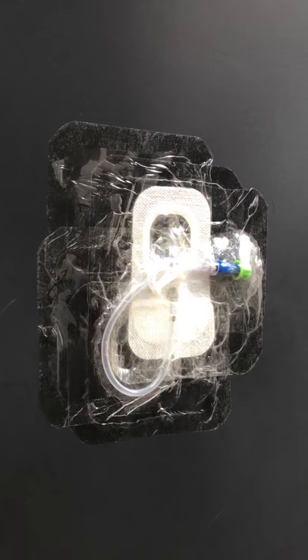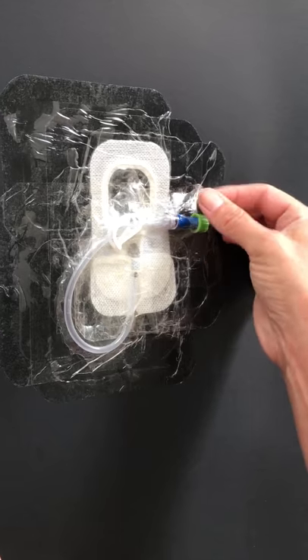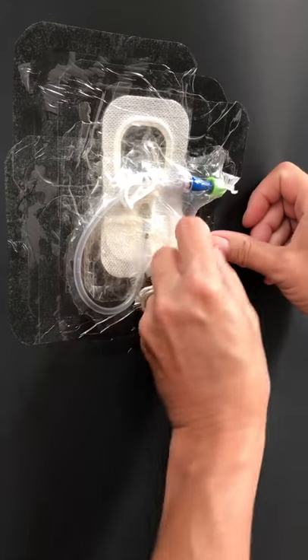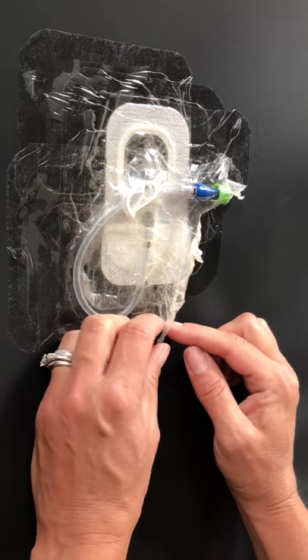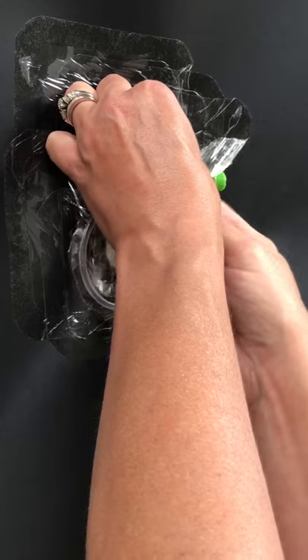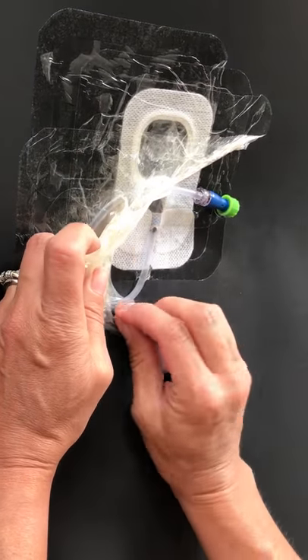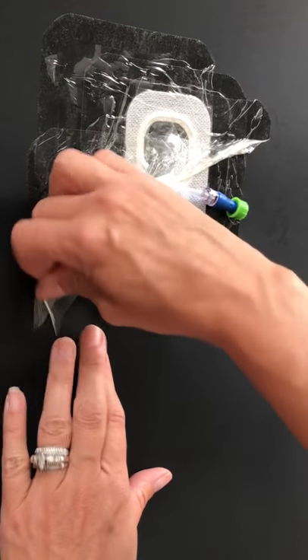With that sterile dressing and the Tegaderm that's in there, if it's fairly new — within the last day or so — you could usually just pick off the Tegaderm that you put on there for them to go swimming, just start by picking at it. It would come right off without even messing with the original Tegaderm. It's not even touching the original Tegaderm that I had down. Now, if that's an older dressing, yes, it's probably going to start peeling at it. You don't want to do a dressing change, but you need to have access to the site — just pick off as much as you can. Be very careful that you don't pull on the line, and just bring the line out to where you can access it. Most times it doesn't even mess with the old Tegaderm underneath if it's brand new — it's not even pulling that off.